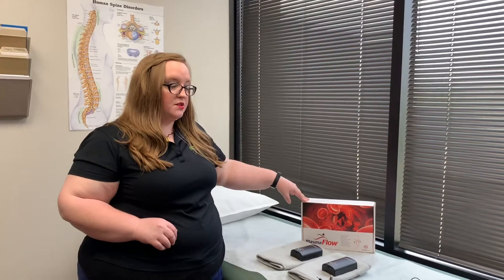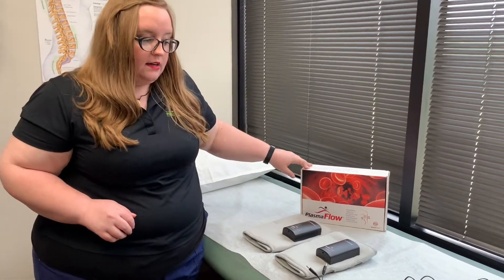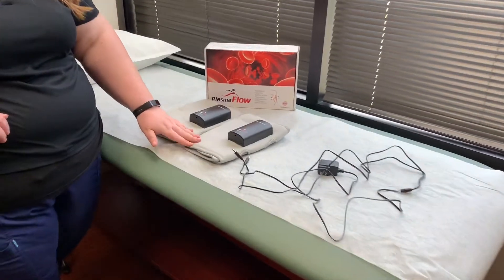This is your sequential compression device, also known as a SCD. It'll come in a box that looks similar to this. Inside that box you're gonna get a power cord and then two wraps that'll go around each of your legs.